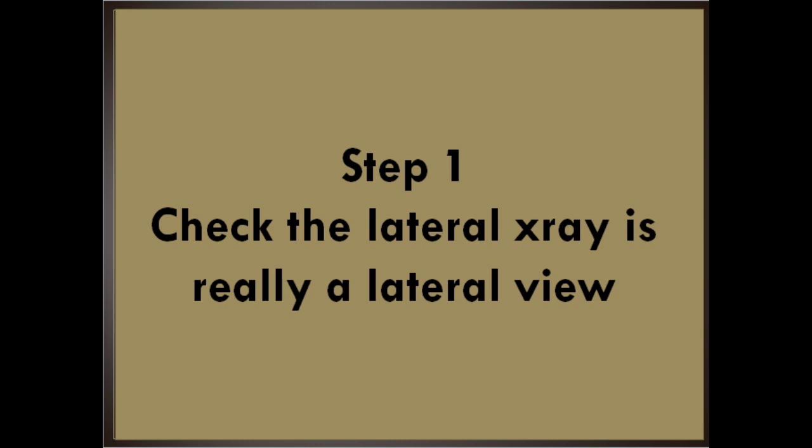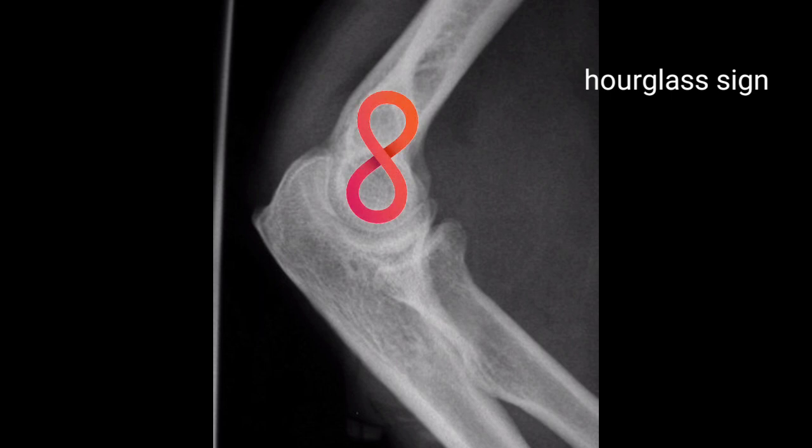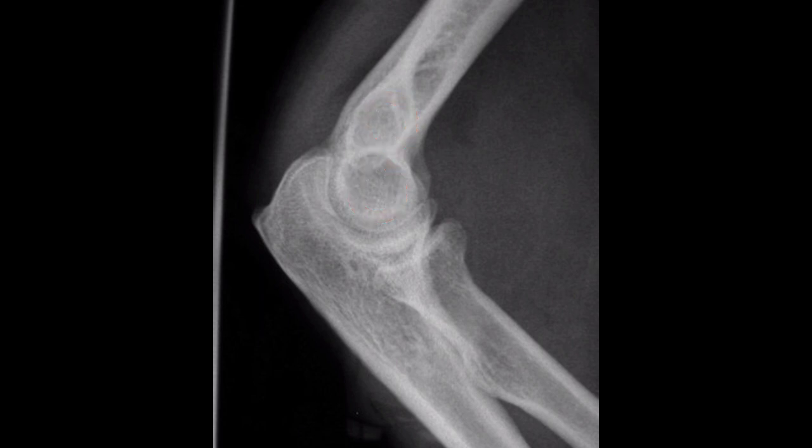The first step is to check that the lateral x-ray is really a lateral view. Look for the hourglass sign, or figure of eight sign, which shows that you are actually looking at a true lateral view. Here is an example of a true lateral. Note the symmetric figure of eight hourglass sign at the distal humerus.